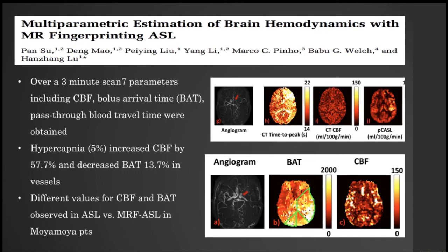And what we're doing over at the Advanced Imaging Research Center is evaluating patients who go through baseline imaging and cerebrovascular reserve imaging. I use a lot of SPECT. We're using CT perfusion as well, but then we're comparing that to a CO2 protocol. When the patient puts on a mask, they're slightly hypercapnic, and then we can see the cerebral blood flow change. This is some of the data from our initial group of patients: a 57% increase in cerebral blood flow in normal patients who were not challenged.